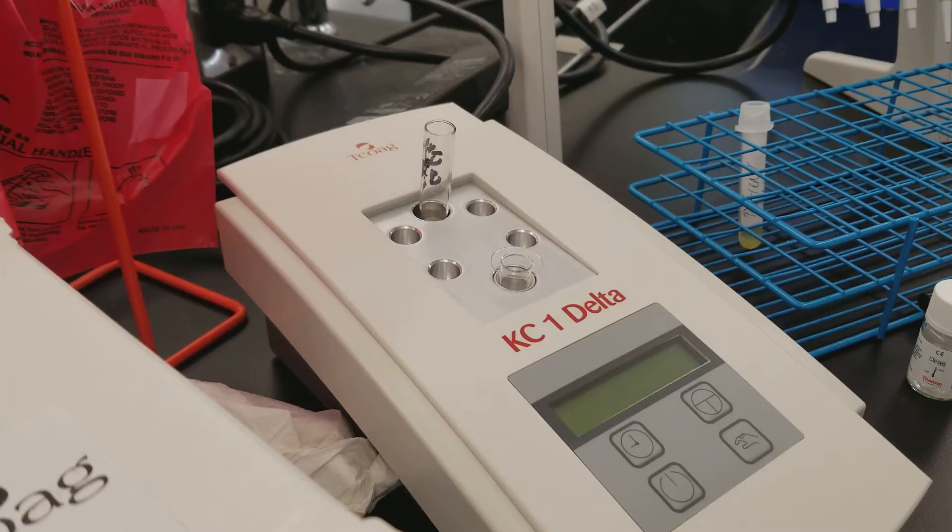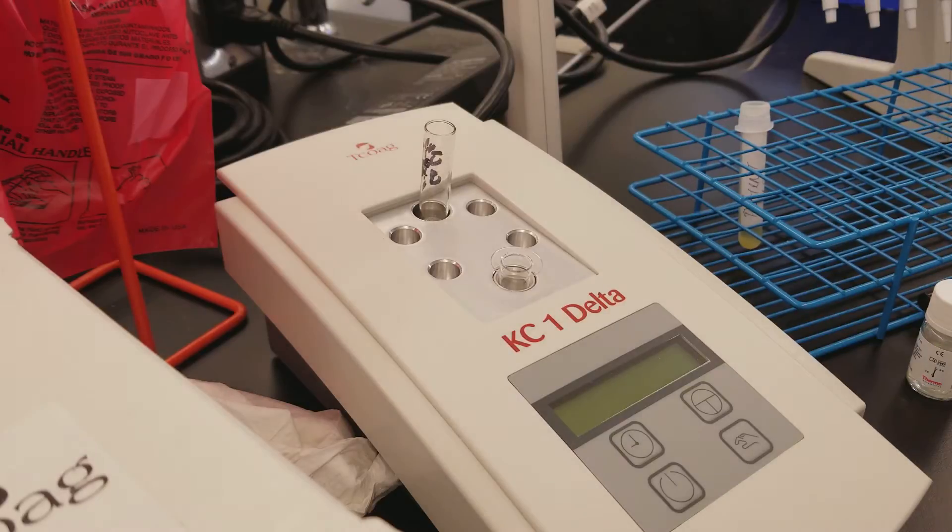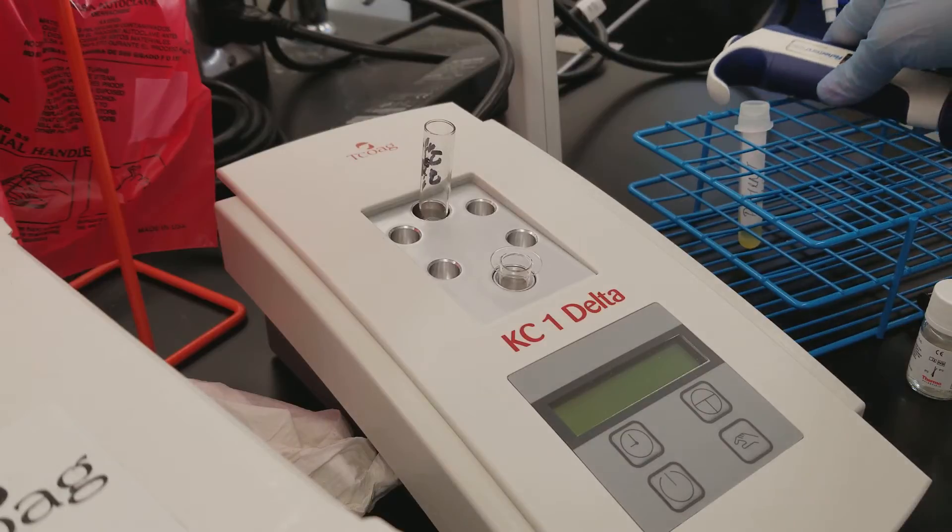Today we are working with the KC1 Delta. This is the coagulation analyzer that we use in class. It is semi-automated, meaning that we have to do the manual pipetting and manipulation of the reagents in order to get testing to be done, whereas on a fully automated analyzer, the pipetting and everything from the patient specimen and the reagents would be done for you.